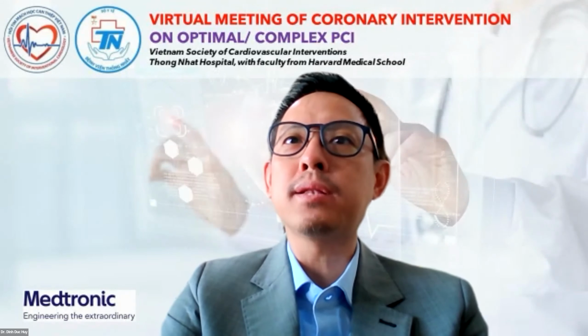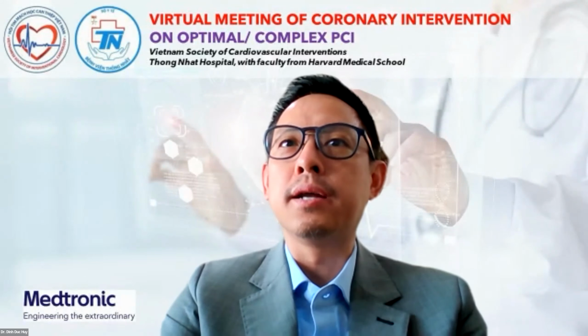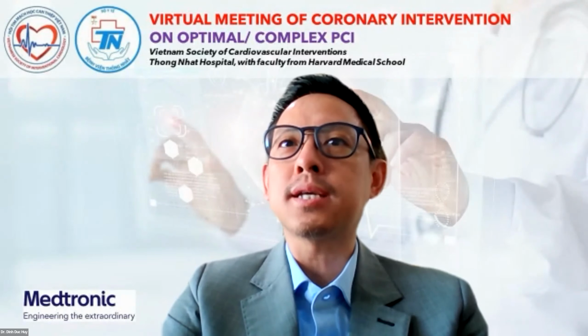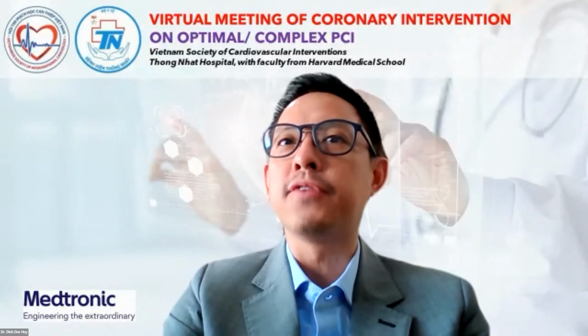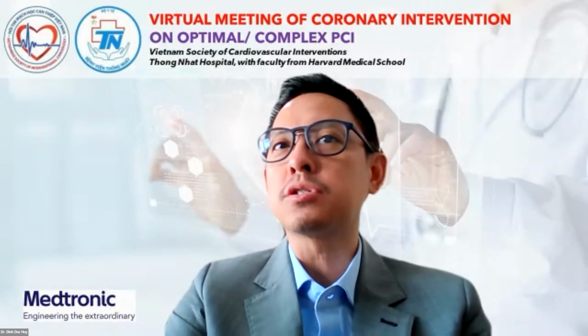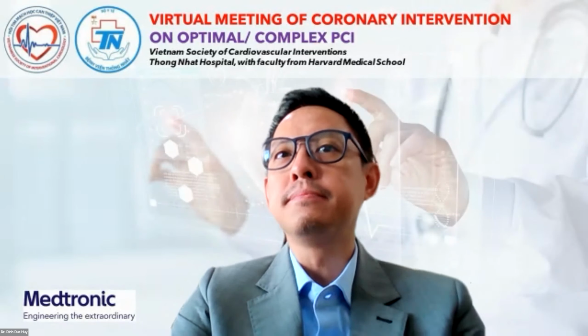So back to the case with the stent underexpansion, when your colleague leaves a stent that is truly underexpanded in the LAD lesion. So the case was successfully treated by laser at your site, but may I ask, if laser is not available in Vietnam, is there anything else that we can do? So the lithotripsy, the IVL technique, does it make any sense in that case?